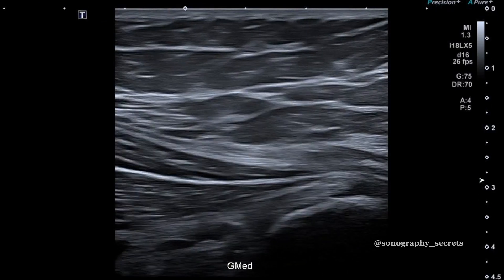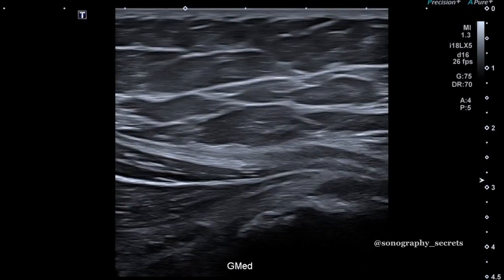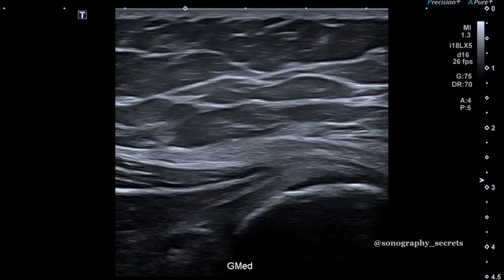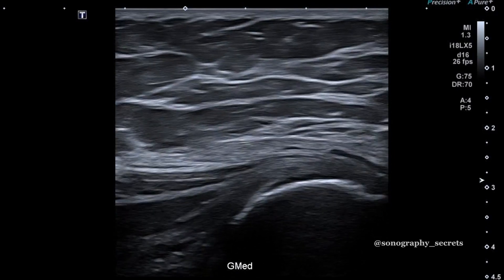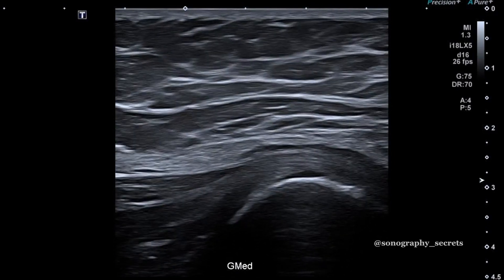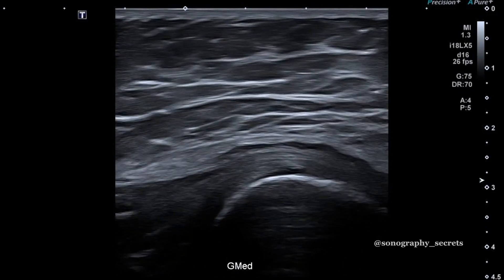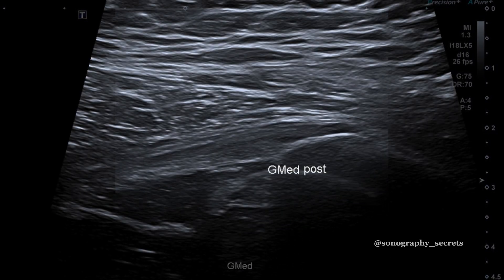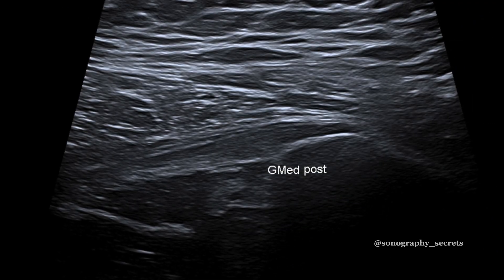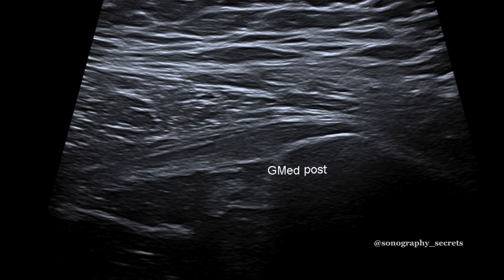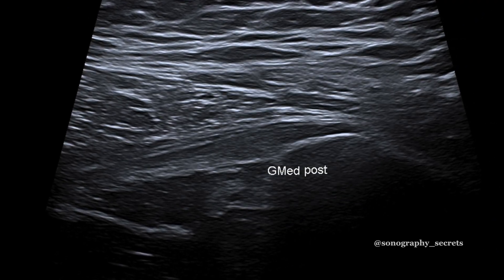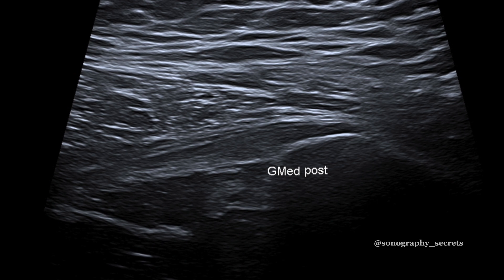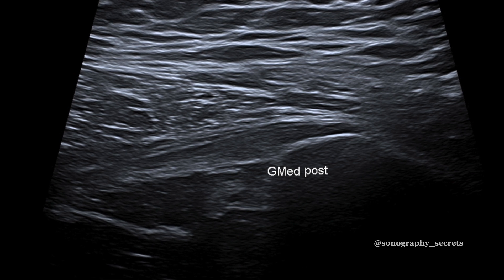And with glute med, we can use the fact that it is bipennate and identify the intramuscular tendon, following this back to its insertion on the lateral facet. For the posterior aspect of glute med, I simply fall off the back of the trochanter to get this image.